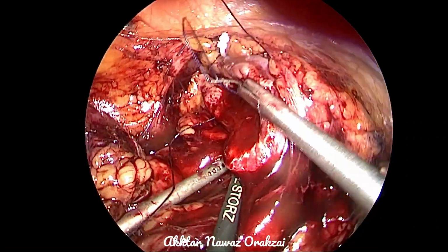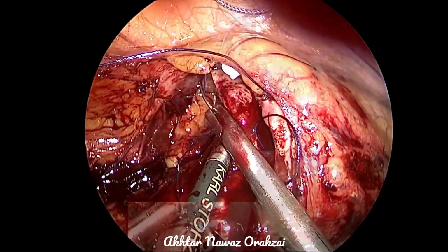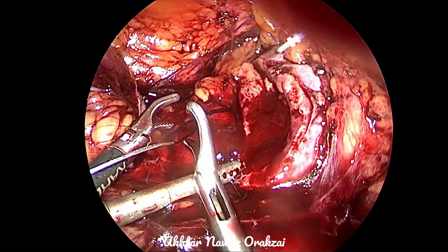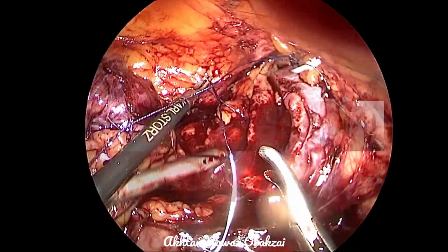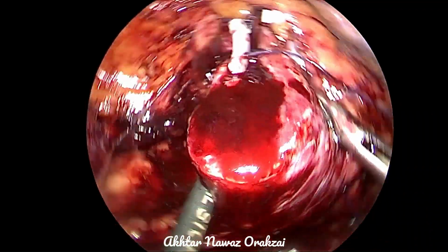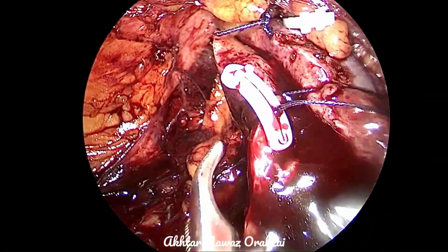Once we close this rent and we declamp the kidney, we will place this tumor specimen into a glove bag. Economy plays an important role in laparoscopy.